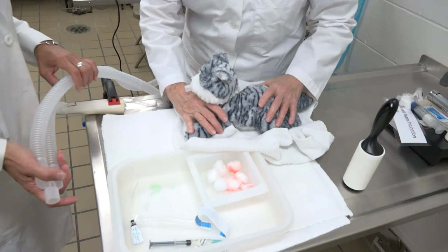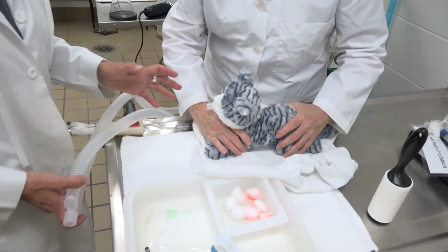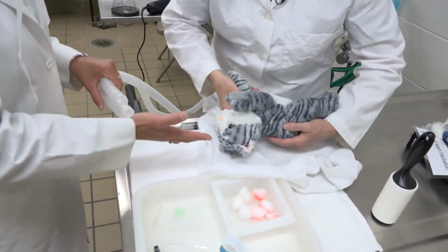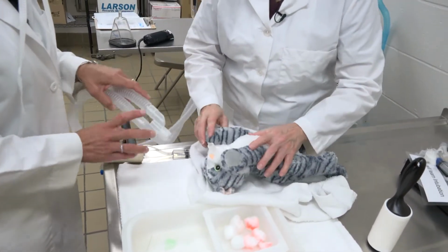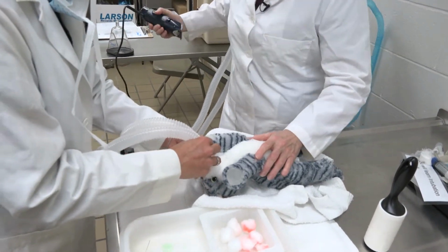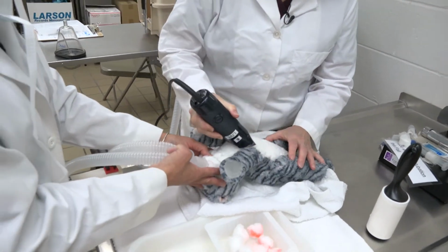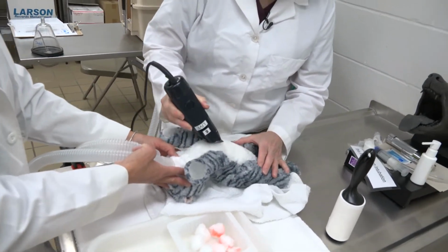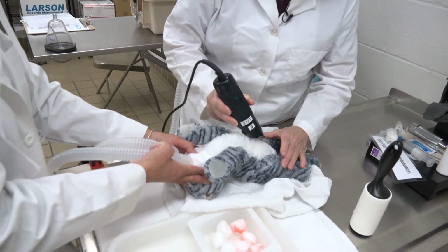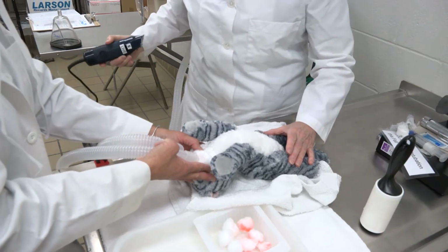And we're going to hook up pre-oxygenation at some point, either prior or with a mask to intubation, or once it's intubated, we can attach this. I'm going to have Dr. Spence position our kitten so that I can easily pre-oxygenate while she is shaving for this spay. And we're going to shave from xiphoid to the pelvic brim, and about a half a clipper's width on the outside of the mammary chain.